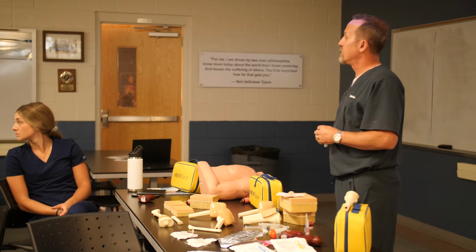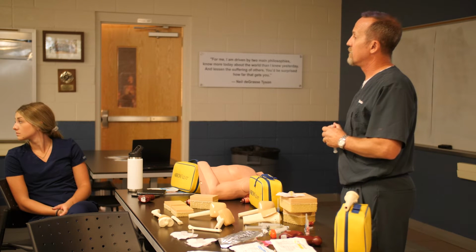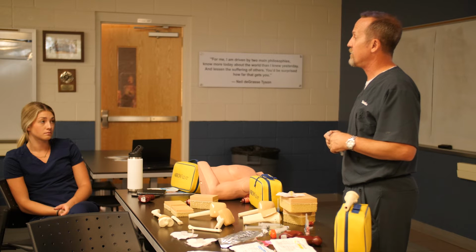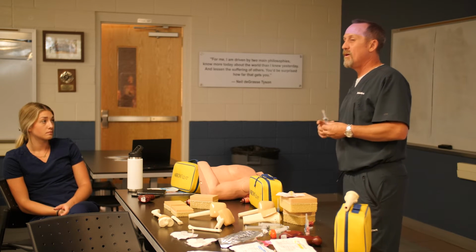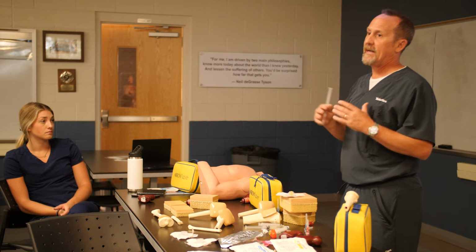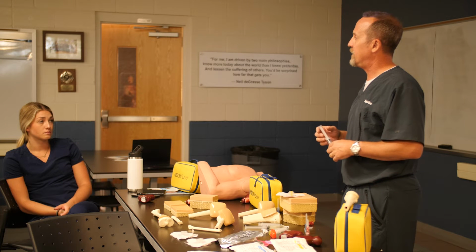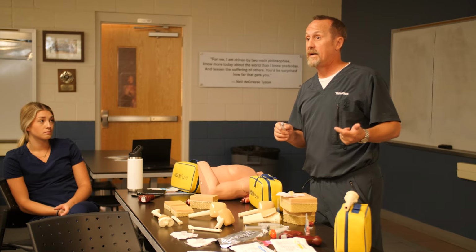And, in my experience, the more room temperature or on the slightly warmer side the fluid is, the more the patient's fine. Yeah, that makes sense, kind of like a nerve sensitivity, like with a tooth when you drink something too cold or whatever. So, one thing I will point out too is, once you get it flowing, and it's been going a little bit, those nerve endings kind of get desensitized to the fluid going through there. So typically, if they do feel pain when you put it in, it's gonna subside a little bit. It varies from patient to patient. So any questions on any of that so far?